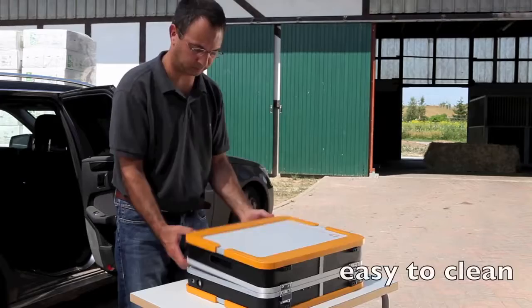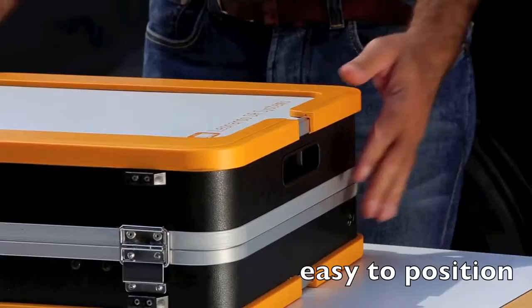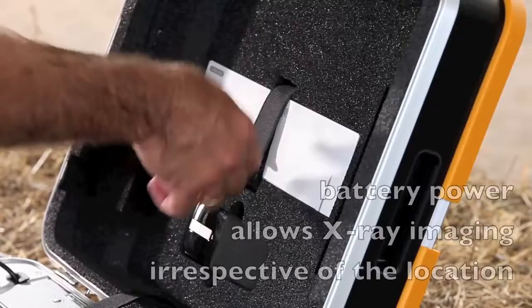The practical, robust suitcase is highly shockproof and easy to clean. The mobile x-ray solution is set up easily in under 30 seconds. Thanks to the wireless detector, tripping over cables and restricted movement are now a thing of the past.